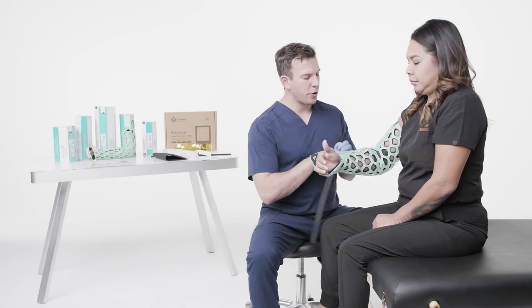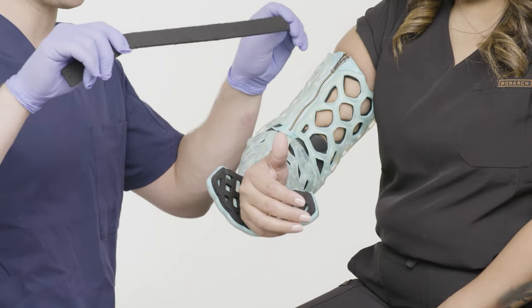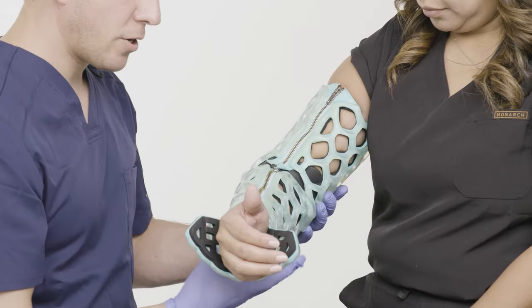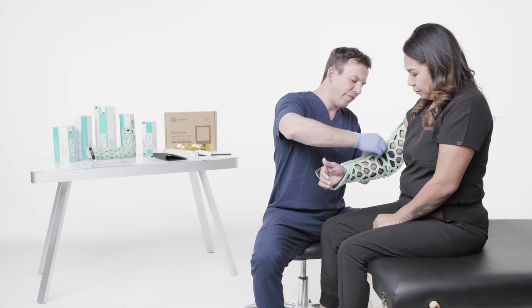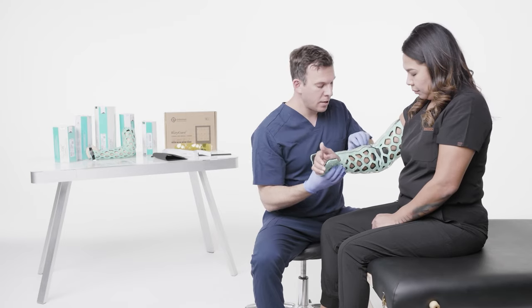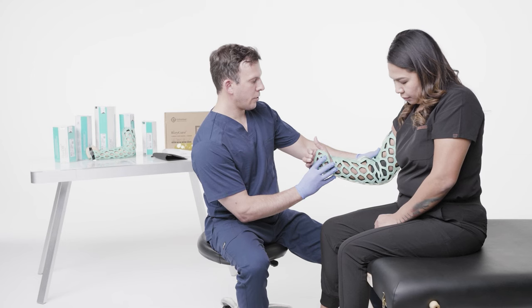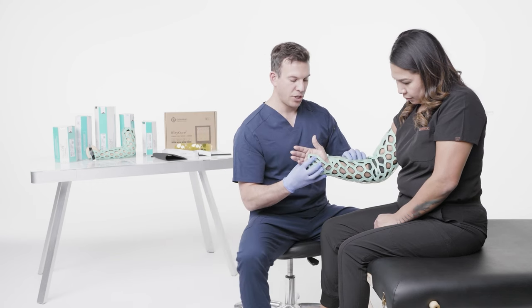As you're inspecting, you might want to ask your patient if the zipper is uncomfortable. If so, you can take a piece of the rubber and put it underneath the zipper to add a little bit more cushion. Make sure that the zipper on the forearm isn't flipped down — it should be flipped up so it sits on top of the zipper straps, nice and straight on the radius. The top zipper is going straight up the center of the humerus. If she sticks her thumb straight up, it should be directly in line with the humerus. She's not over-pronating and not over-supinating.